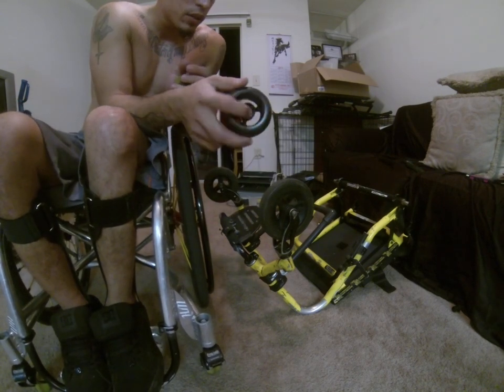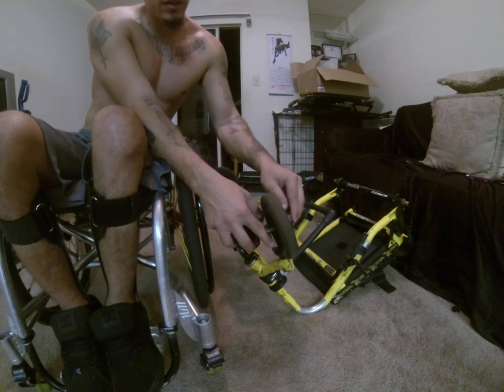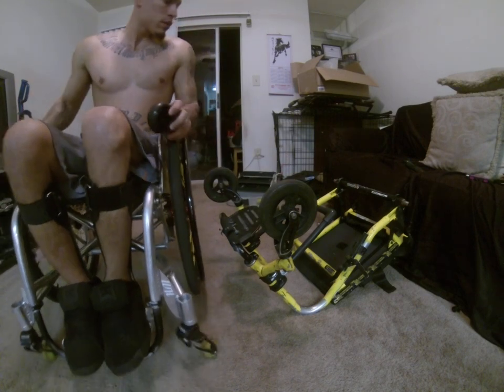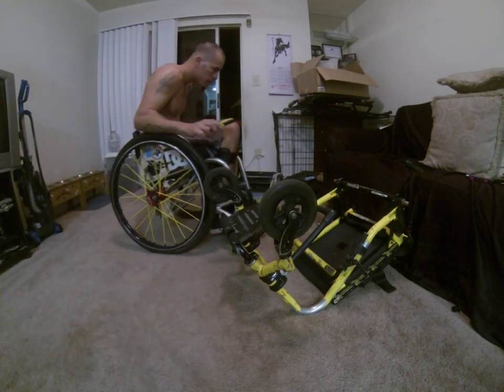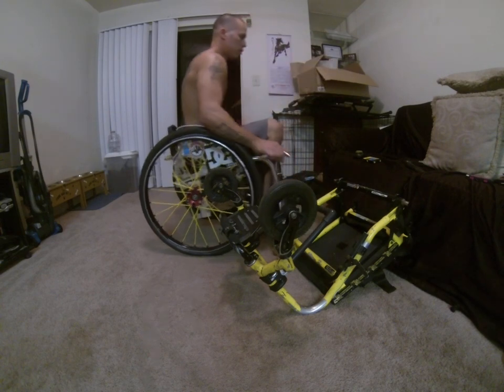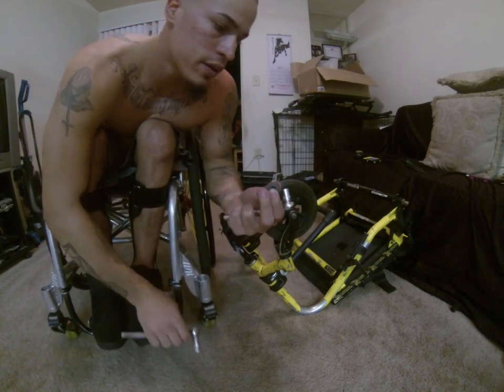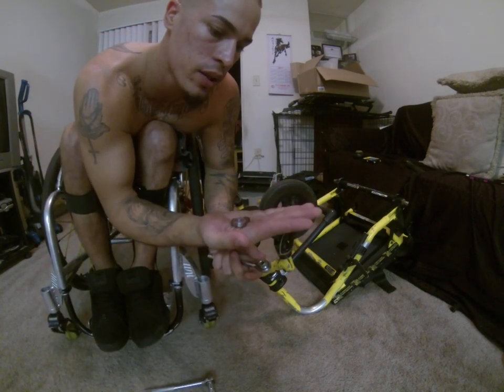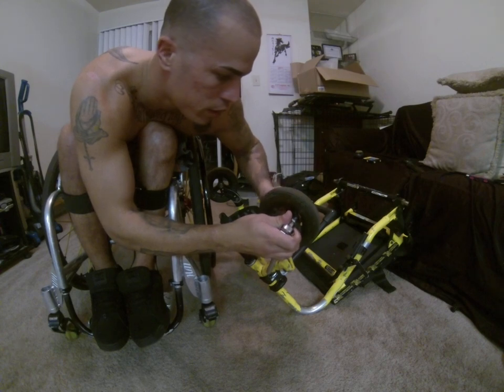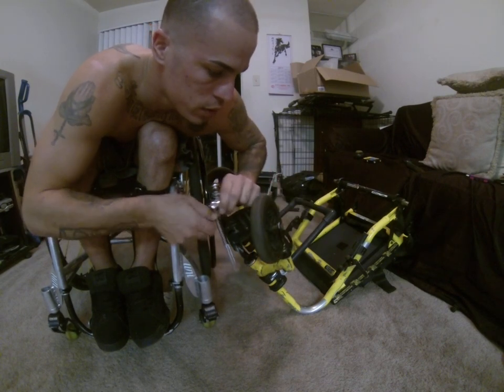Alright, basically what you're going to do is unbolt these bolts right here and pull out the hardware and put it into this wheel. Simple as that. I'll show you how it's done. I'm going to put some bearings inside. These are the bearings. I got some reds. They spin really good. Basically what you're going to do is just take this off, pull out all the old stuff that's inside here, and put it into the wheels you're going to get.